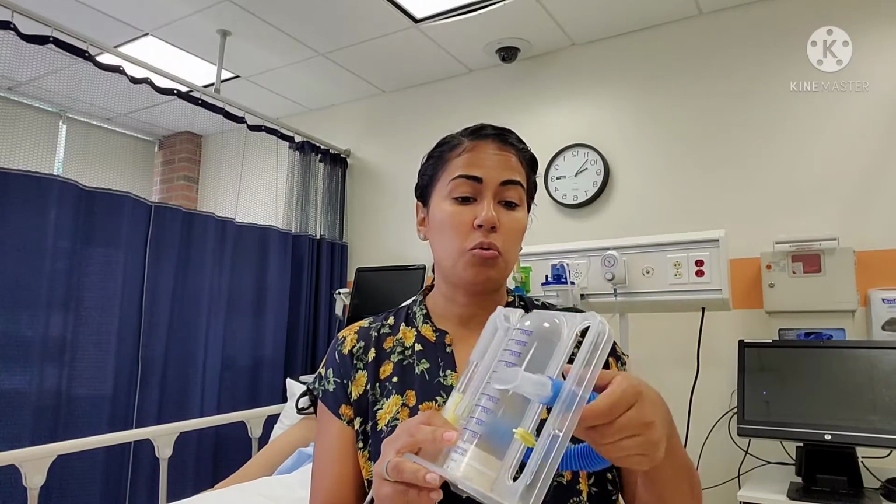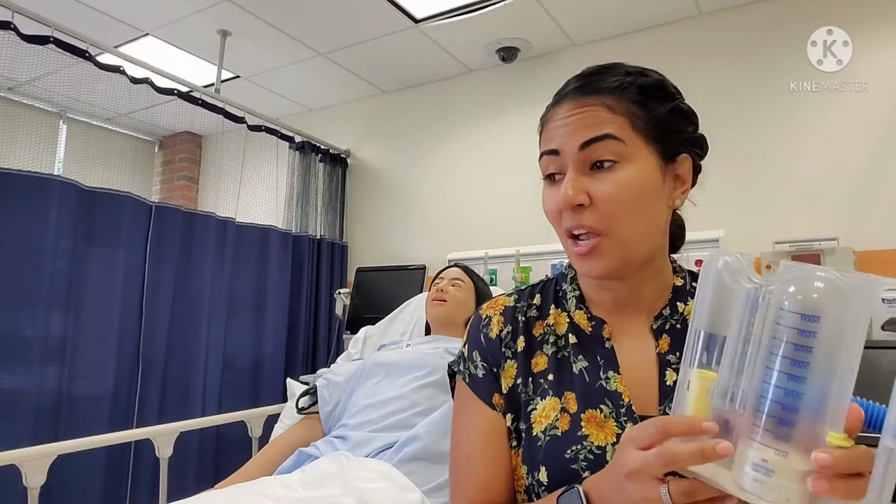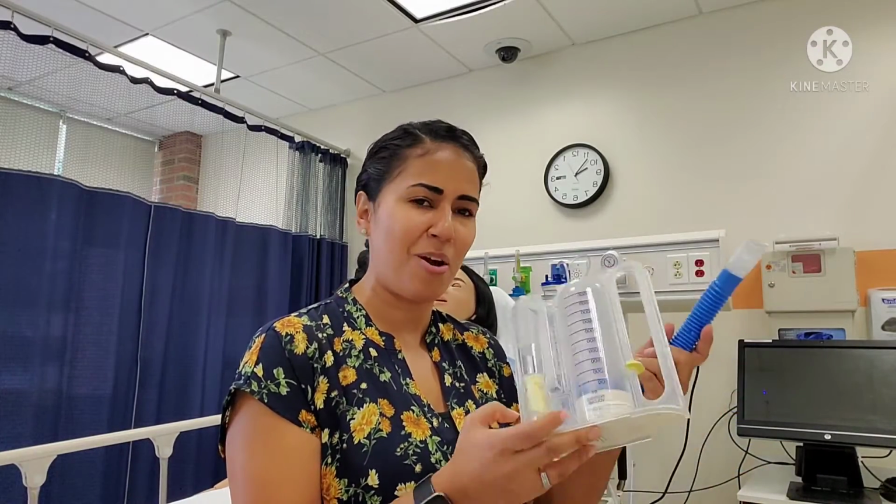And how would we use this? Is my patient going to blow into this, or is my patient going to breathe in? Now, one thing that I always do when I come in to meet my patients, I always say, hey, can you show me, have you been using the incentive spirometer? And they say, yes, I've been using it. And then I say, okay, let me see what you got. Let me see what your skills are, how we're doing, right?